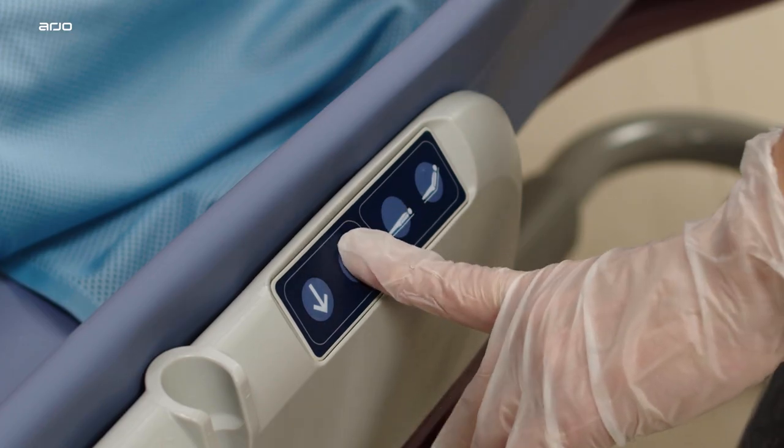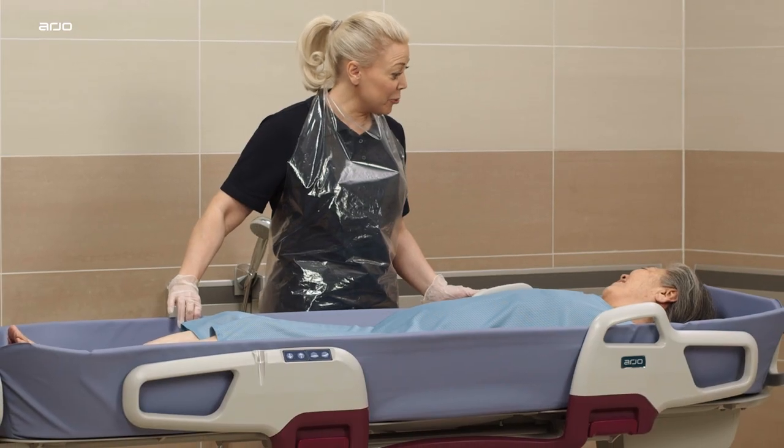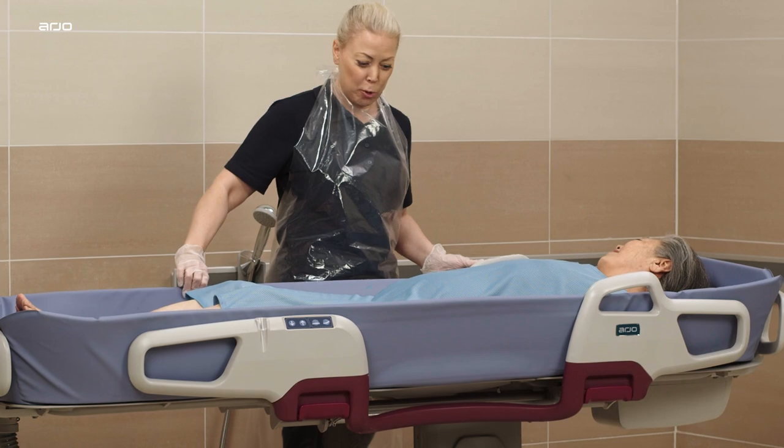The height of Corivo can be electrically adjusted using the up-down arrows on the control panel. Adjust the height to enable good working postures for the caregiver.